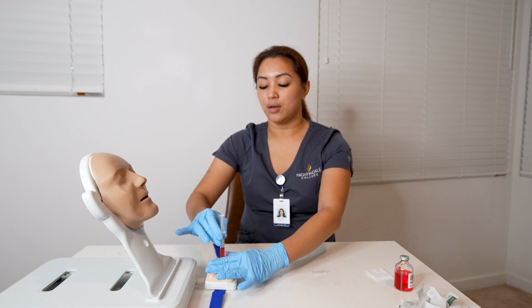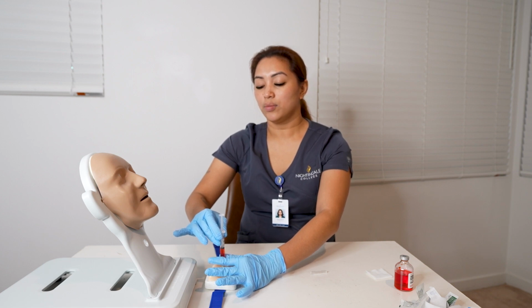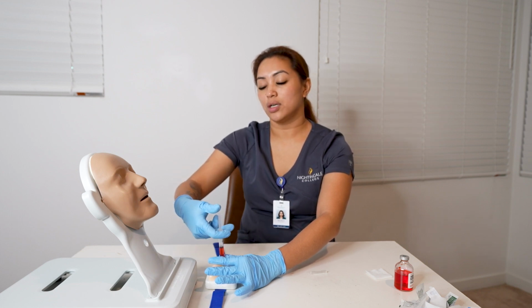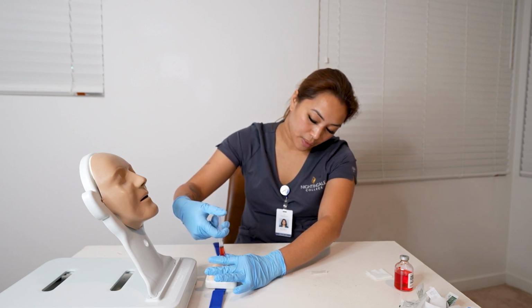All right, so now that it is in, I am going to hold the syringe barrel with my non-dominant hand. I'm going to pull back just to see if there is any blood. There's no blood. All right, perfect. So now I am going to inject the morphine sulfate 10 seconds per milliliter. Alrighty.